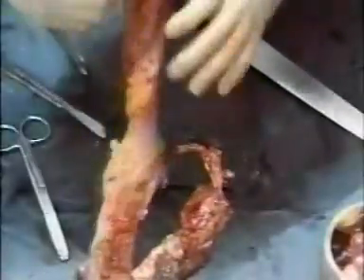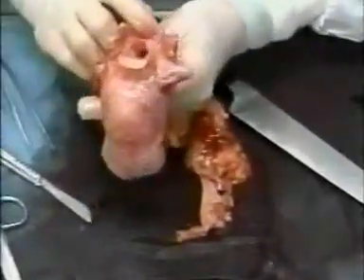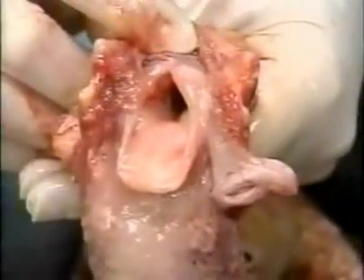Now we're doing the neck block with the attached tongue. This is the epiglottis here. The vocal cords can be seen down in that opening. This is the anesthesiologist and paramedics' view. This is what they see when they're trying to intubate somebody.